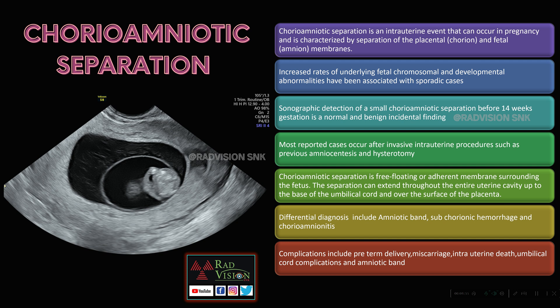Chorioamniotic separation occurs in pregnancy and is characterized by separation of the chorion from the fetal amniotic membrane. Normally you are not able to see the amnion separately from the chorion. Increased rates of underlying fetal chromosomal and developmental abnormalities can be seen. Most reported cases occur after invasive intrauterine procedures such as amniocentesis and hysterotomy. Chorioamniotic separation appears as a free-floating or adherent membrane. The separation can extend throughout the entire uterine cavity up to the base of the umbilical cord or over the surface of the placenta. Differential diagnosis includes amniotic band, subchorionic hemorrhage, and chorioamnionitis.